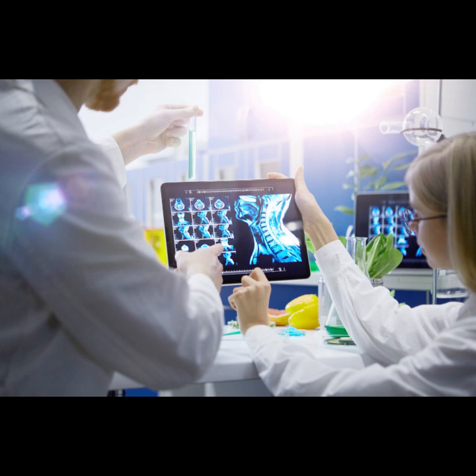You got it. So the phase encoding step determines which line of k-space we're on in the ky direction, and the frequency encoding gradient, Gx, lets us sample the data along that line in the kx direction.